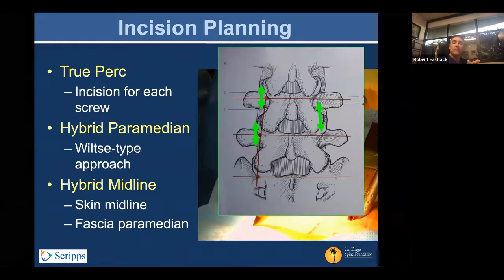When you do PERC, plan your incisions — you generally start with the AP view. You can choose one of the following incision types: on the right picture, on the left side you can see two vertical incisions centered over the starting point for each pedicle; on the right side there's a singular incision. It's really dealer's choice. Many people like the two-incision technique; I like the single incision — I find it's more cosmetic and I can use my finger more reliably to palpate, which reduces fluoroscopy load.